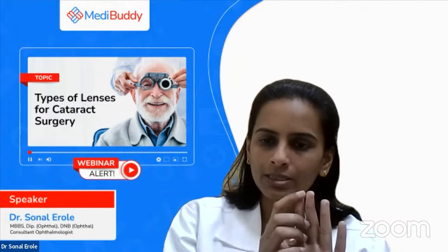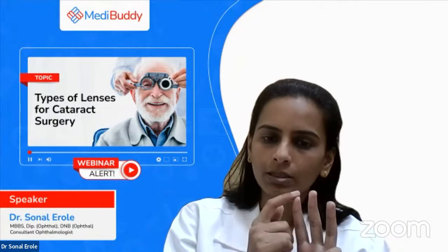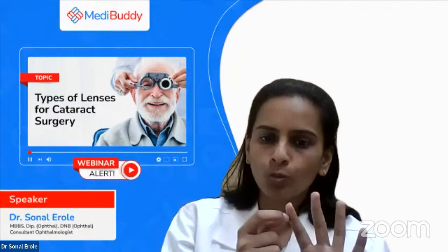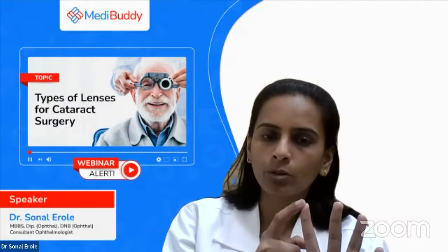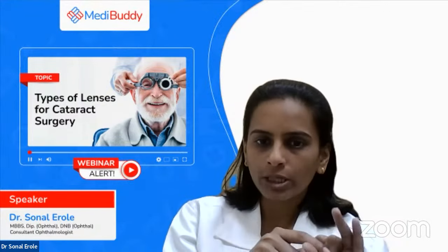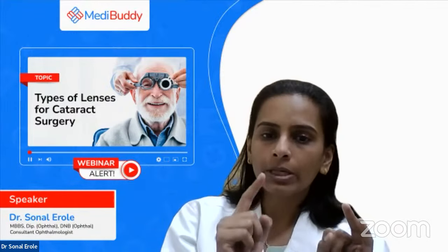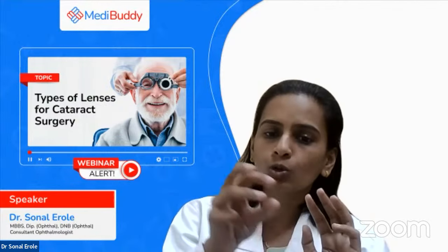So this moderately priced and practical option has to be discussed with the patient and then we can decide. The patient needs to understand whatever lens he is putting, what all properties it is going to have, and if it is okay with that, then we can go with that lens. So it will not be a generalized statement that go for this lens. It will depend on all these factors and can be decided on a patient to patient basis.